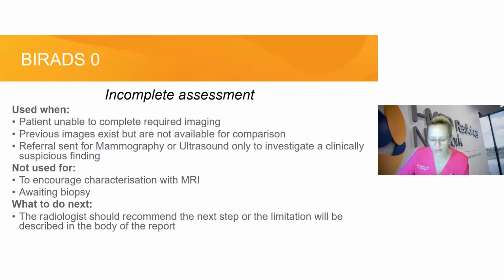This BI-RADS category should be assigned either at the end of one or another study, or a combined mammographic and ultrasound examination. We then reach a BI-RADS category, and sometimes that requires an MRI for characterization or for level of concern. So we shouldn't use a 0 to have an MRI, and we shouldn't use a 0 while we wait for a biopsy. It should be the BI-RADS category that drives the biopsy, not the other way around.